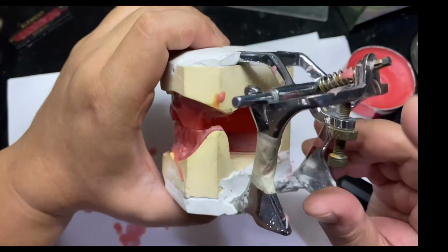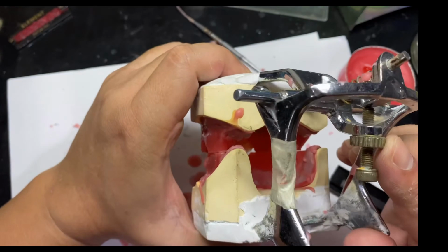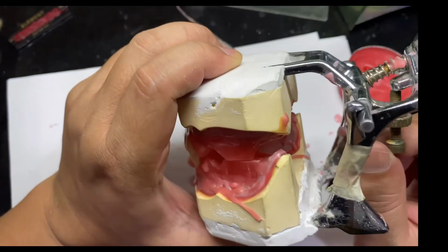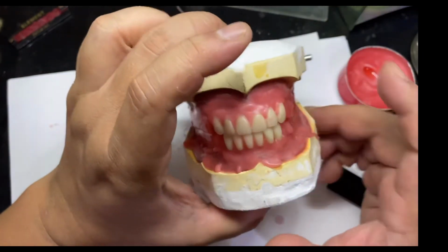And then check the incisal pin. Make sure that there was no increase in the vertical dimension of occlusion. It's still in contact.